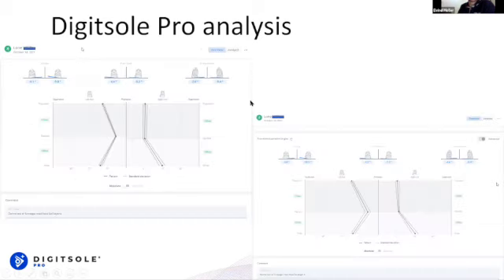So this was on the first visit. This is the same visit where we can see the trajectory of the pathway. On the left, you see the running analysis of the Gel Kayano, and on the right side, you see the running analysis of the Paradigm 6 from Altra. What we see is how she's running through the trajectory of heel strike, foot contact, and then the propulsion of getting off in the running.